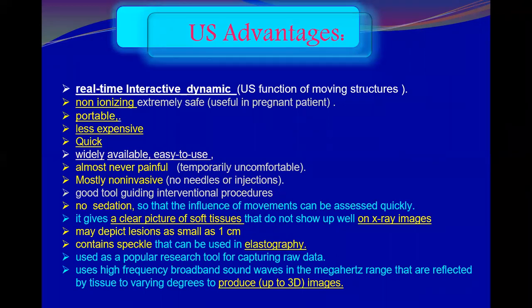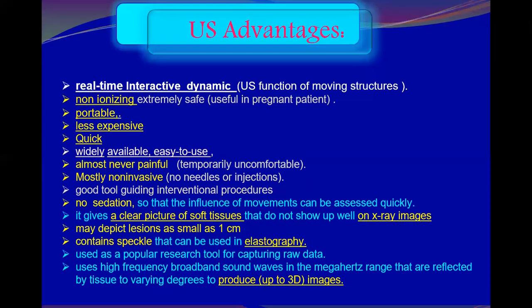What are the ultrasound advantages? As you know, there are many advantages. The most important: non-ionizing, accessible, relatively low cost, quick, and a unique opportunity for real-time guidance of needle biopsy. If we find a lesion, it is easy to biopsy using ultrasound, and so forth.